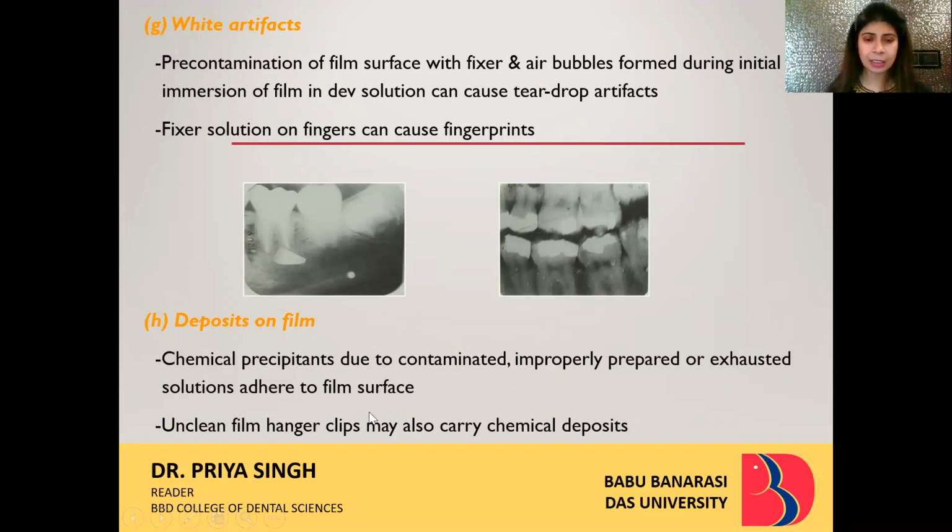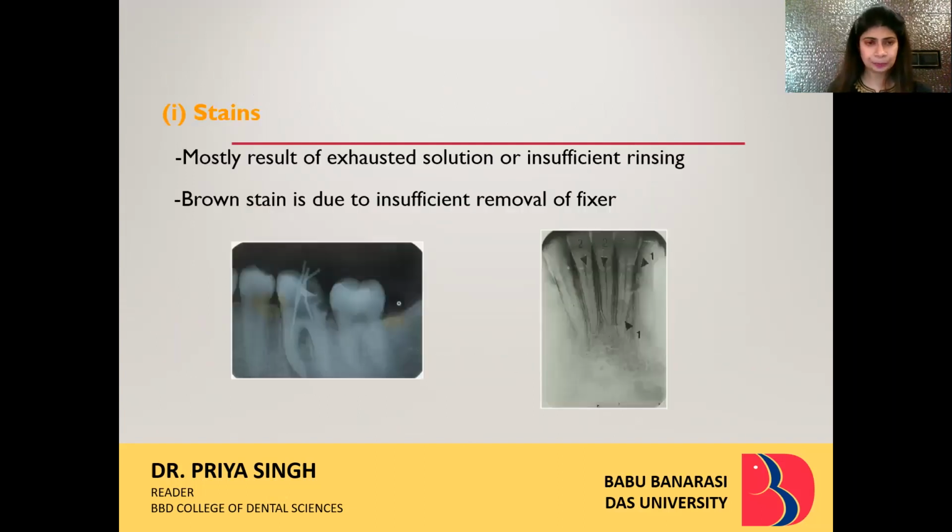Unclean film hanger clips may also carry chemical deposits. So after every day's exposure, or every day's darkroom procedure, all the hanger clips should be cleaned. And you should be sure that they are dry before actually clipping on your IOPA film.